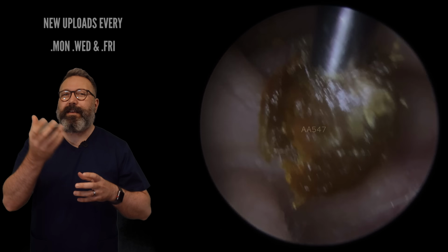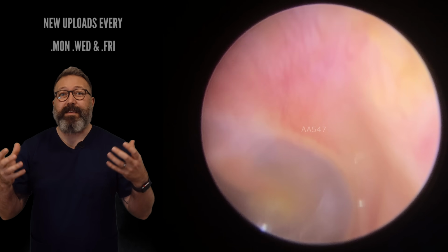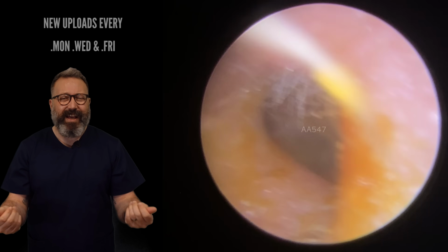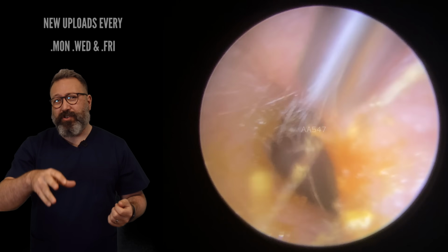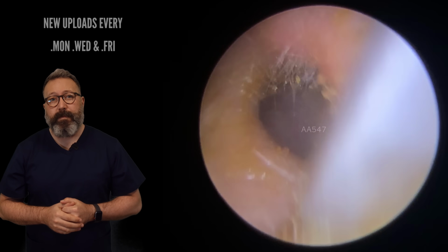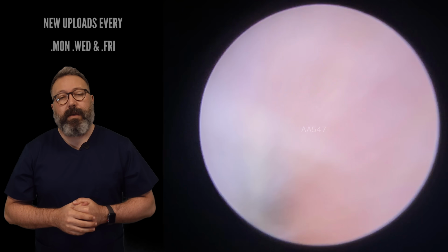You can see a little bit of lighter material, that drier skin. Now, I expected the ear canal here to look really messy, just because that wax is so soft and sticky and tacky, like it is here on the surface. But it was actually pretty clear. Didn't look too bad at all there. Let's clear away this section at the front. There. Oh, we didn't go back in.